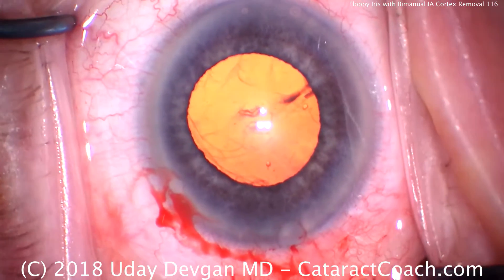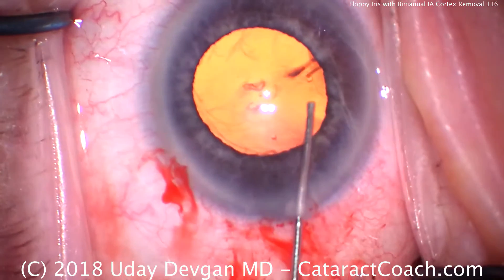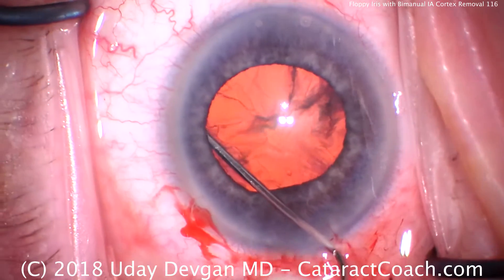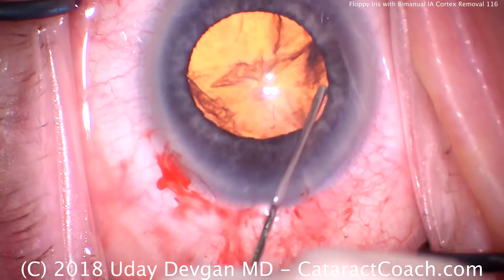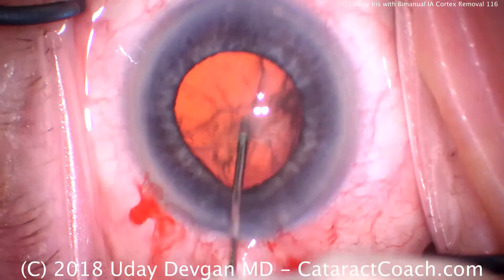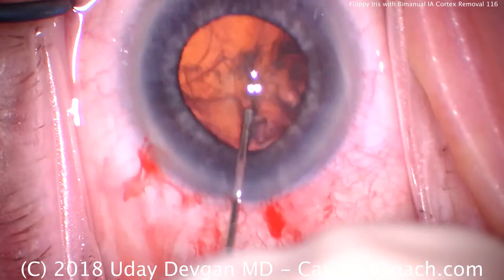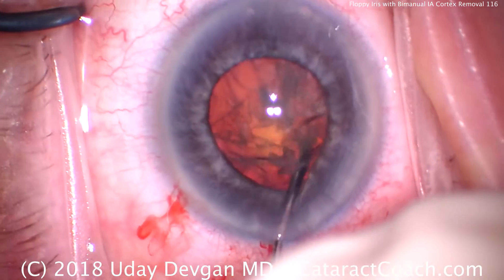Now we'll do some hydrodissection. Be careful — we don't want too much pressure behind the iris because that would cause more prolapse. We'll get a little fluid wave, then another fluid wave. Let's see if we can spin this nucleus — maybe another fluid wave. And does it rotate? Yes, it certainly rotates.